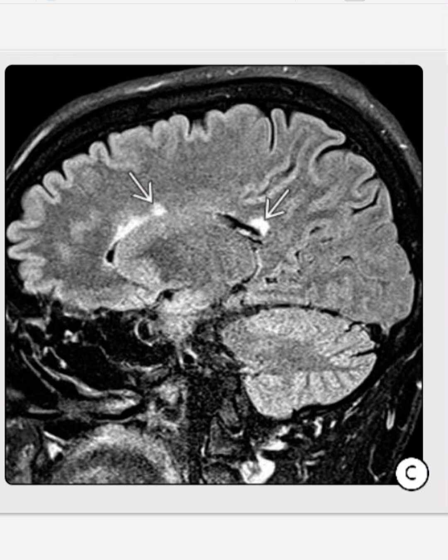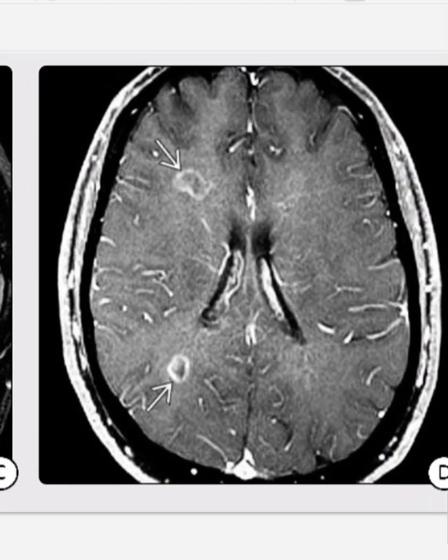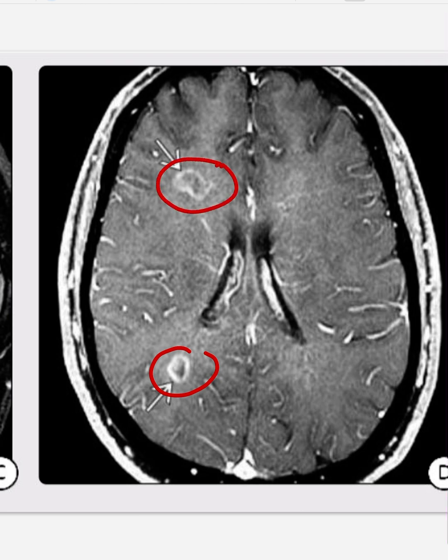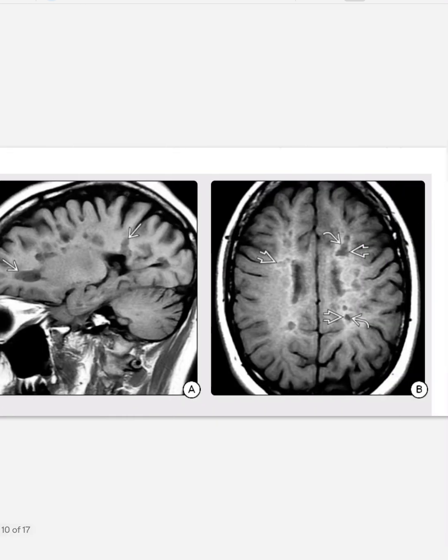The FLAIR demonstrates triangular-shaped periventricular lesions with irregular ring enhancement in some lesions and no ring enhancement in others. This represents another case demonstrating heterogeneous enhancement patterns typical of multiple sclerosis plaques at different stages of activity.